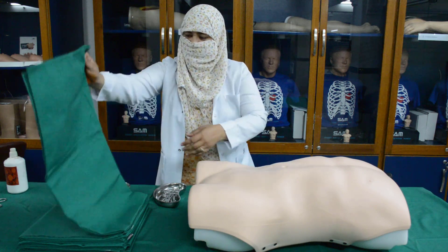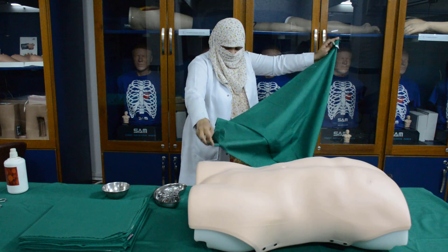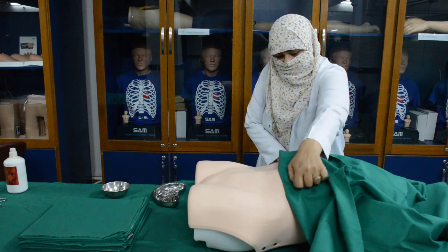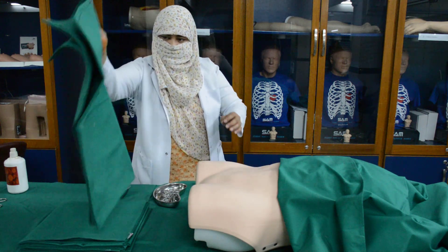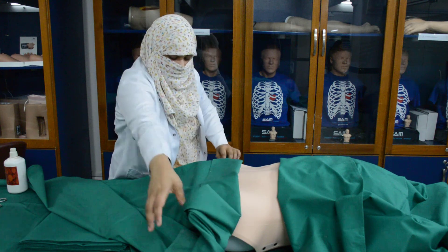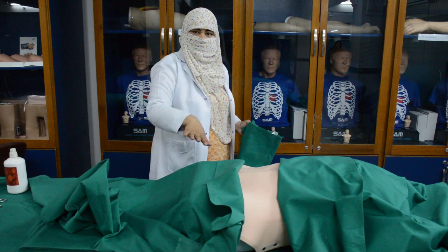Now you have to open up the towels. Be careful not to touch the towels with the table, because the table is unsterile. We have to start placing towels from above and from below, leaving the part that will be used for surgery. We are folding a part of each towel so that we can easily apply the towel clips. First put towels up and down, then on the sides.